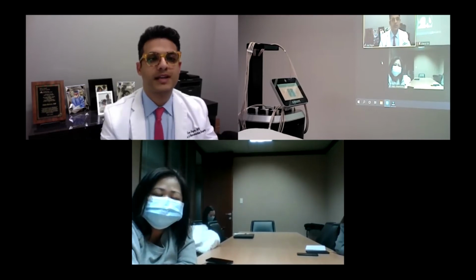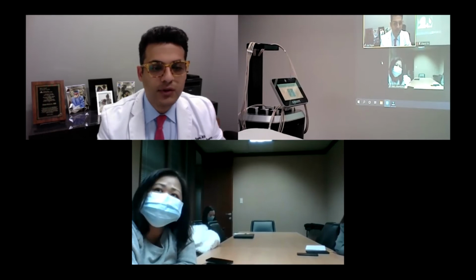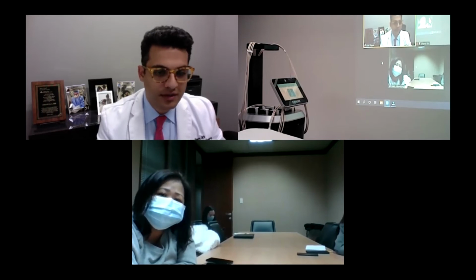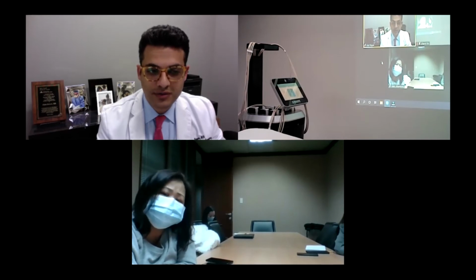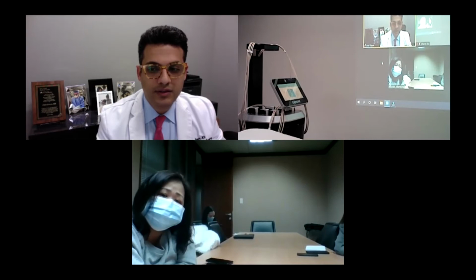So in terms of combination of treatments, when I look at a patient, let's take a look at 3 different types of patients. If you have a heavy patient, BMI 30, not very muscular, basically what they need is fat reduction and skin contraction. So those are the 2 applicators we use. We use the tight and we use the trim. And you can add muscle stimulation as well, but those are the 2 things.